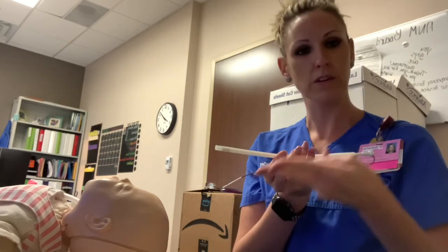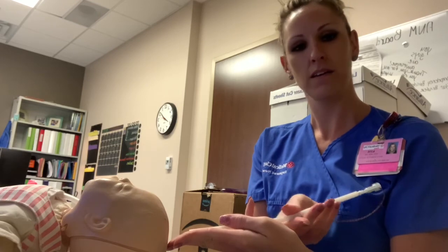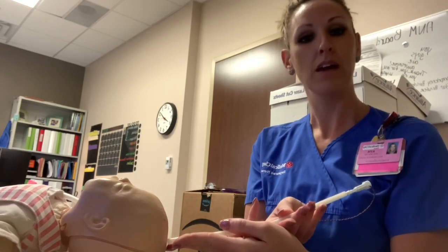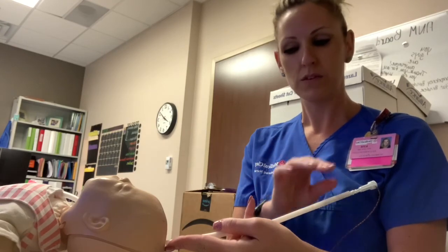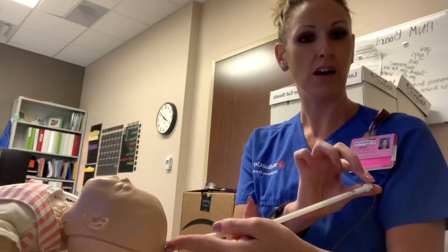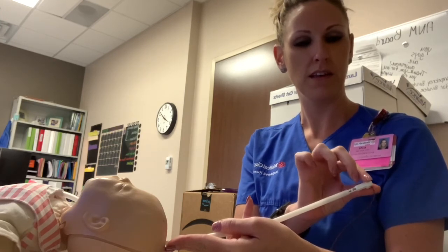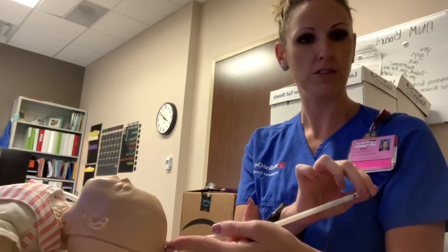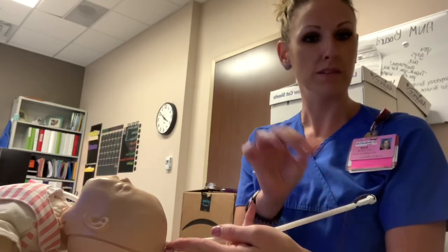We're going to slide through our two fingers until we reach the fetal head. So it'll look like this. Just slide. Okay. Now it has a little bit of pressure against the fetal head. So now that we're in our position, we're going to take our lock, we're going to push against the fetal head, and we're going to turn it clockwise, just about 1.5 times, or until resistance is met.